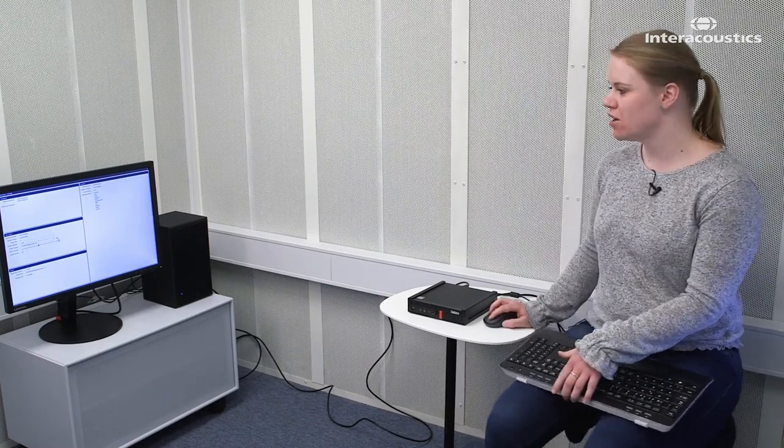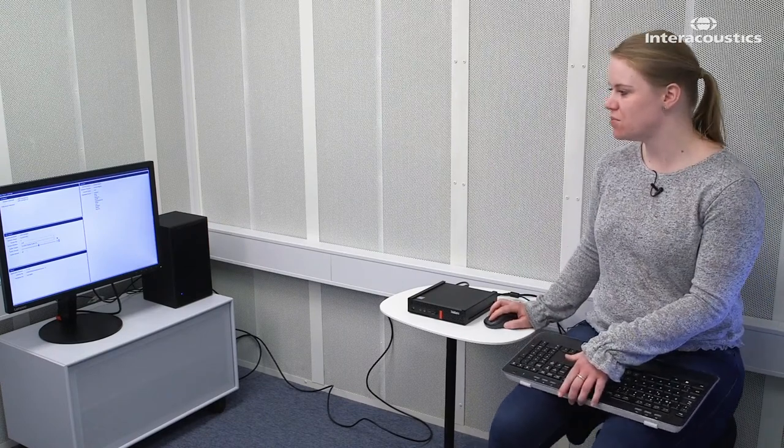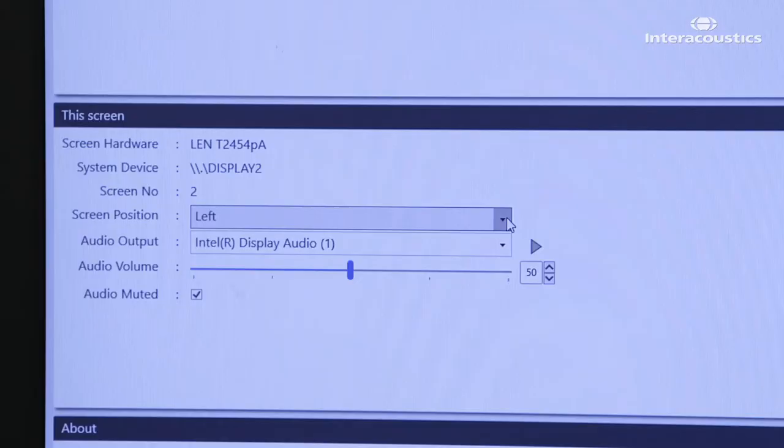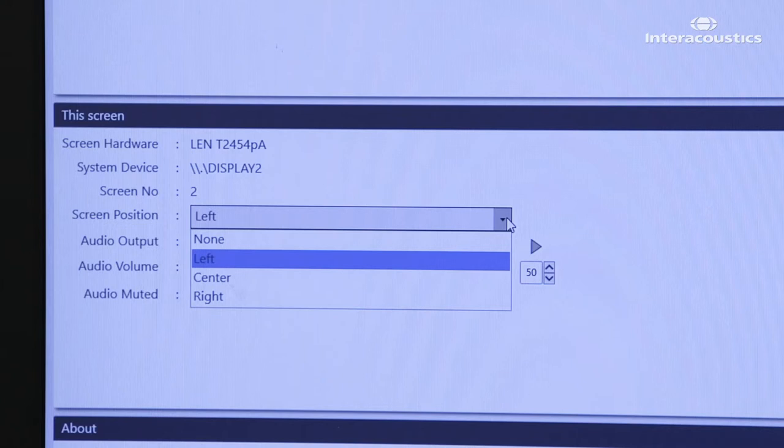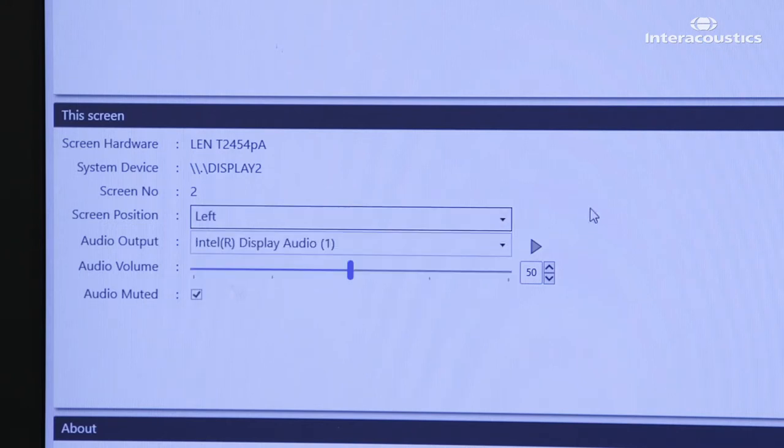In here, you are able to set up the screens for left, right, or center, or you can set it as none if you don't want to use it in this setup.